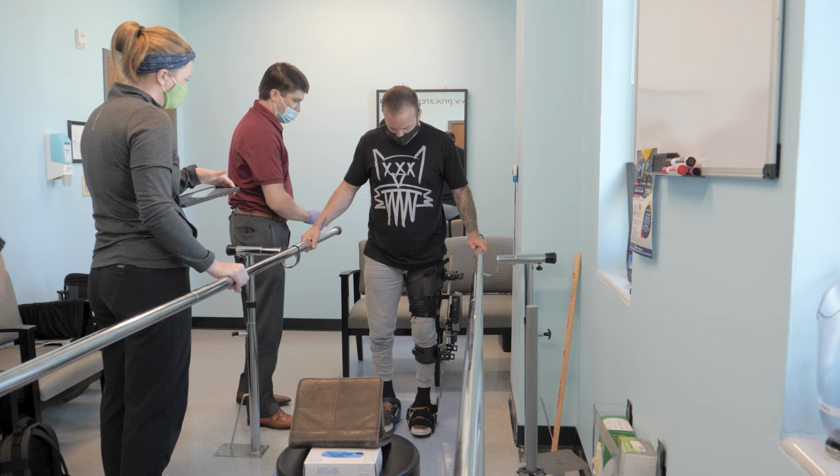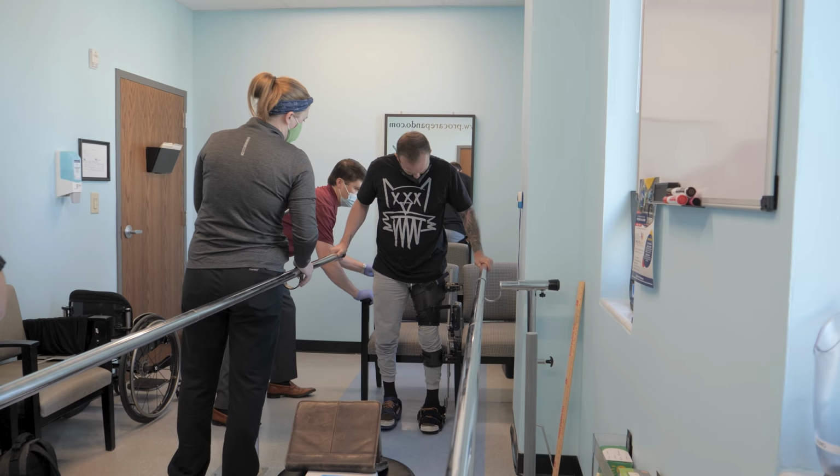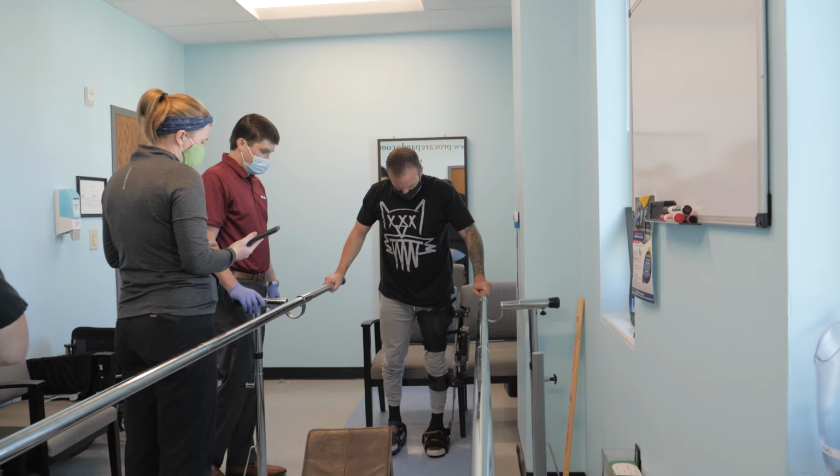So what I want you to do is nose over toes, fanny back, and then sit down, but I want you to load the orthosis too, so this is kind of different. So now you're just going to go ahead and sit down. Ride that knee down. Look, is the stance control on there, Mark? Gone. Now let's try that again.